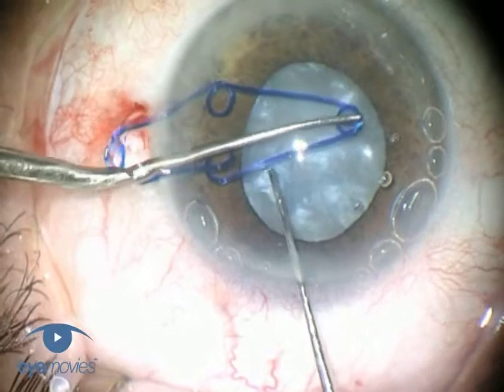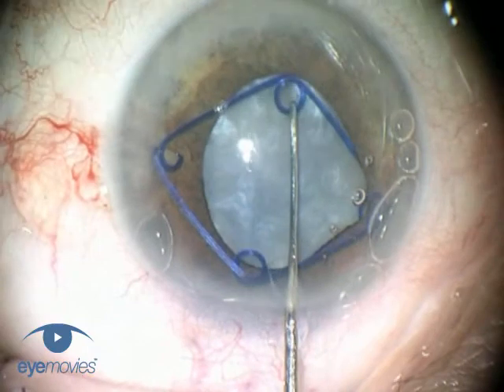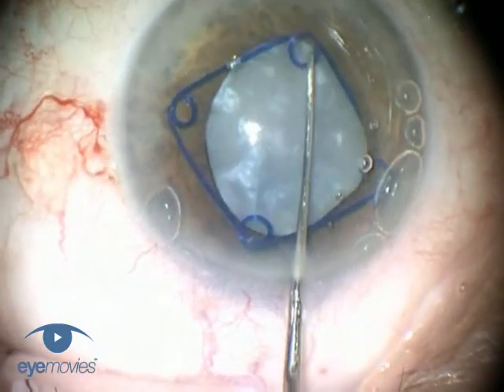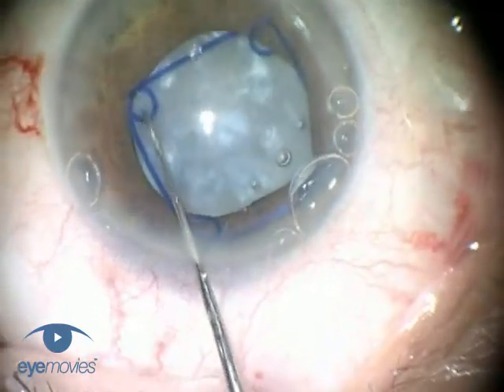Its flexibility means that it can be inserted through a 2.2mm incision, using either a hooked second instrument like this, or there is now available a customized disposable injector from MST, and this can be used for both its insertion and removal.